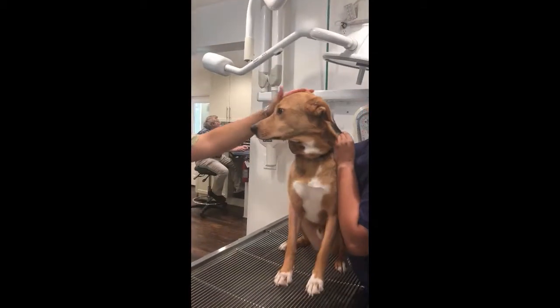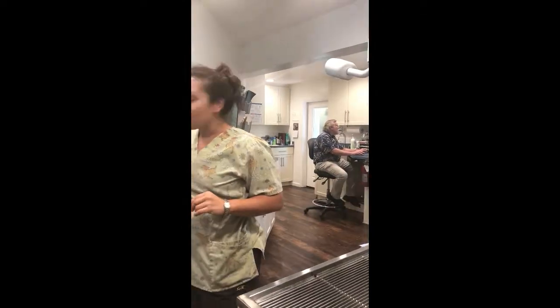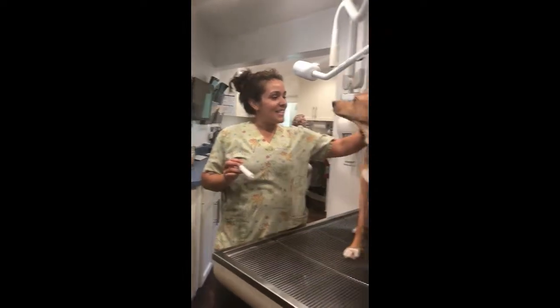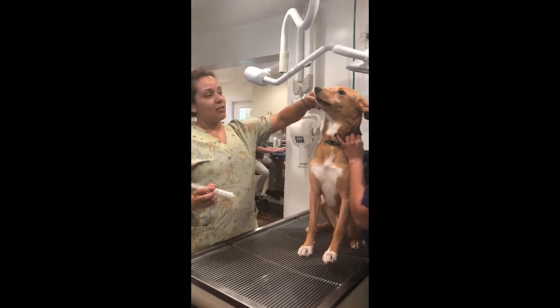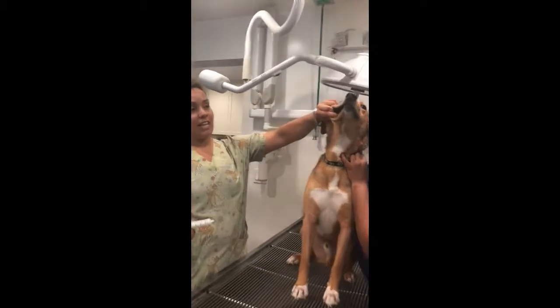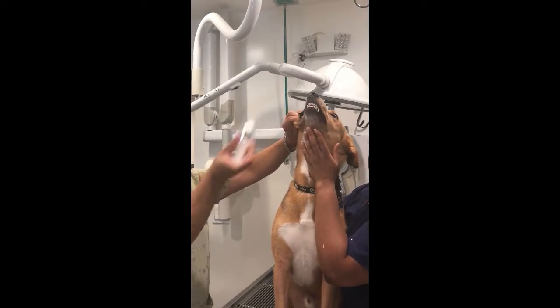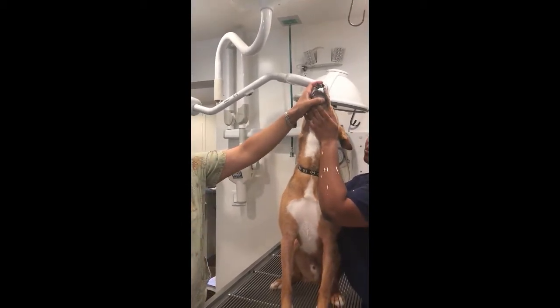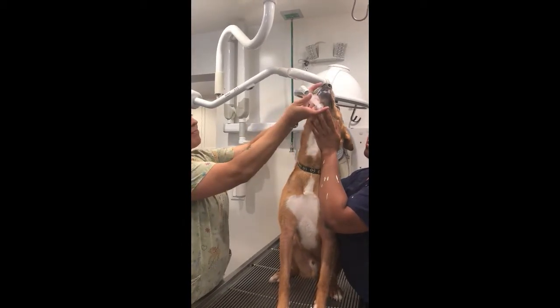Our volunteer is going to be getting some barium because, you know, he's a lab type, so maybe he ate something. A dog this size would normally get around 100 cc's or so, but he's going to have just a little snack today. So the easiest way to give it is in the little cheek pouch right here. He's already licking just from opening it. So you can just put it right in here as they drink it down and make a big giant mess everywhere. Just give a little at a time.